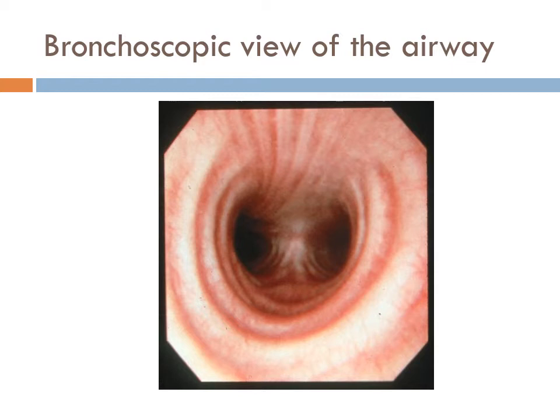Because if you flip the image, we're upside down. We want to go on the left side, but the left side right now is on the right. So we physically have to put the scope in, and we have the fiber optic scope, and we're trying to get it in. We're going to turn the scope. You use your hand to turn it left, you use your hand to turn it right. Thumb down usually flips it up, push on the control up and it flips down. So I'm going to turn and push my scope in to the right, but it's really the patient's left.